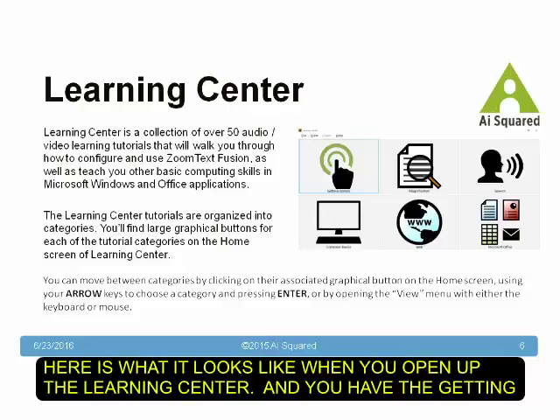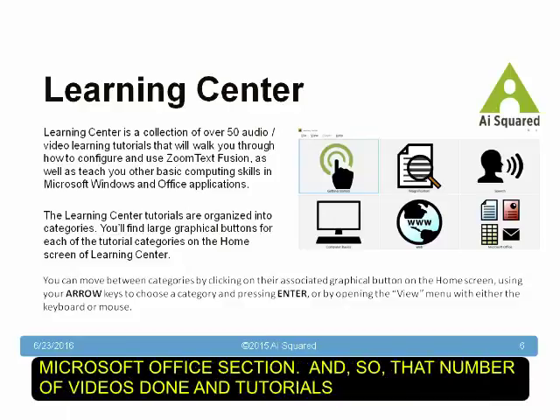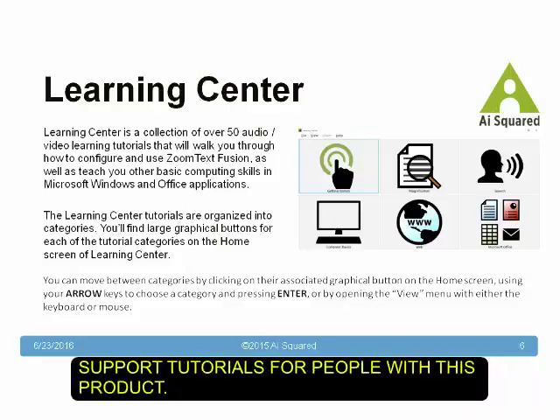You have a Getting Started section, a Magnification section, a Speech section, a Computer Basics section, a Web section, and a Microsoft Office section. So within there are a number of different videos that relate to the subjects at the top. And the number of videos and audio tutorials that have been done is growing as we move forward with the product. It's not something that we just stuck with 50. As we come up with new videos, AI Squared actually has somebody that they're paying to provide these support tutorials to people who have the product.